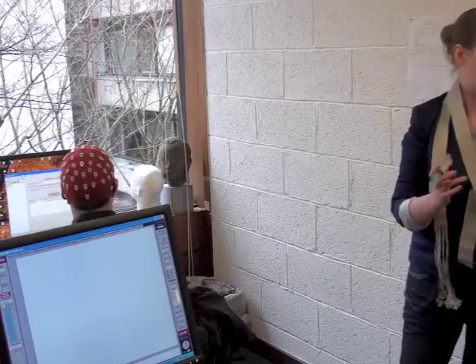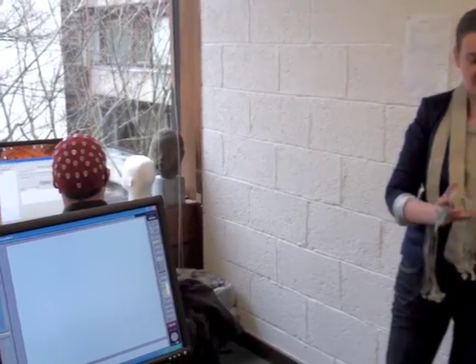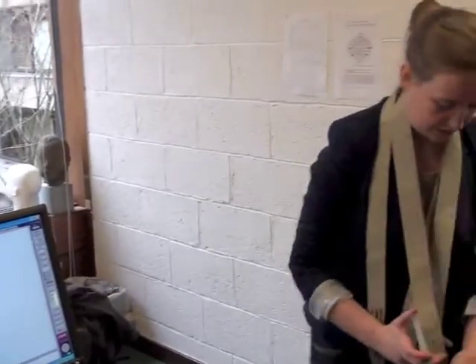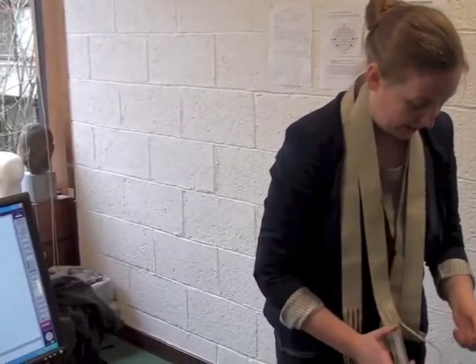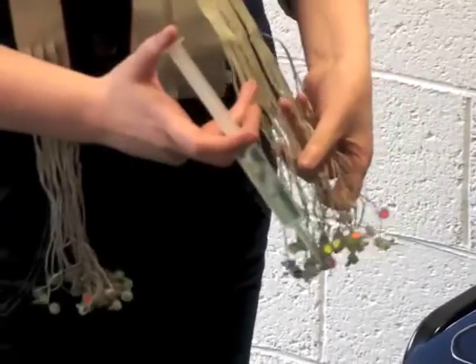Okay, so I'm going to start with the left ones. You know they're the left ones because all the odd numbers are the left ones. I said I was going to start at the back, and these all are in order, starting from these ones, which are the front, and these ones, which are the back. They go in order, so it's easy to get it right. Okay.